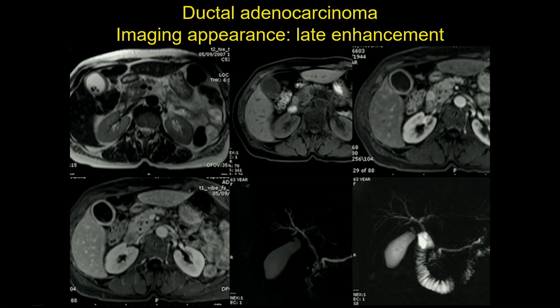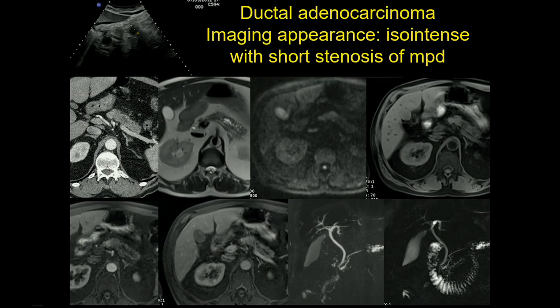We can see here the obstruction of the main pancreatic duct, which does not reverse after injection of secretin. This can be a way to differentiate neoplastic stenosis from non-neoplastic stenosis of the Wirsung duct. The stenosis of the Wirsung duct can be the only way to suspect pancreatic cancer when the lesion is very small. This patient had a hypoechoic lesion, not clearly visible on CT or MRI, but again we see stenosis of the Wirsung duct which does not reverse after secretin.